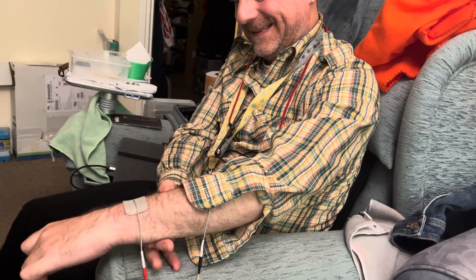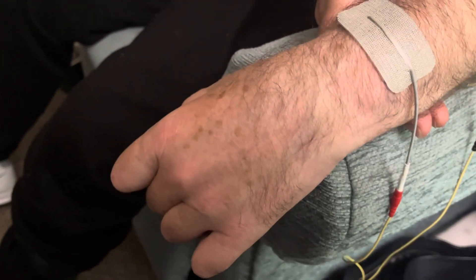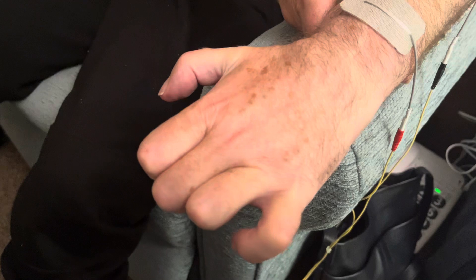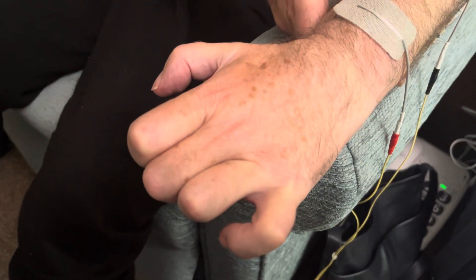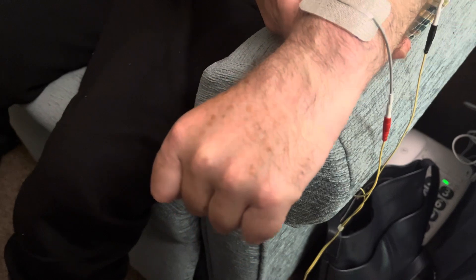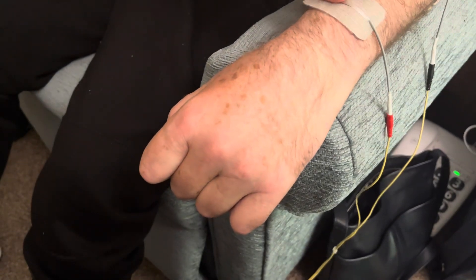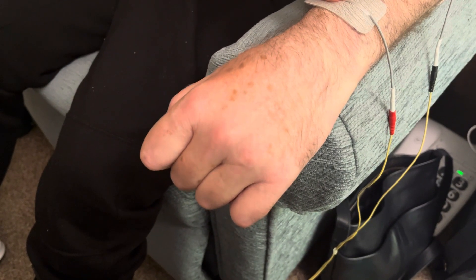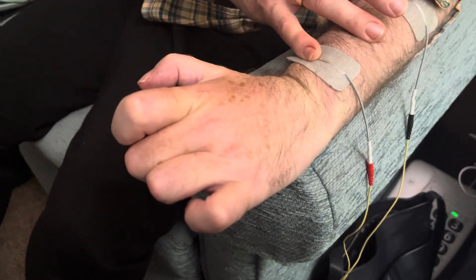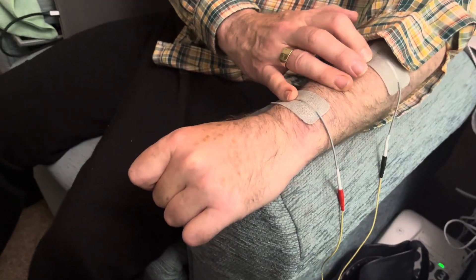Don't suppose you can see the fact that the thumb's sticking out. There it goes — why is that? That's not at all pleasant. But it's doing me good. Well, that's what we've got to keep thinking, isn't it? Well, it should be.